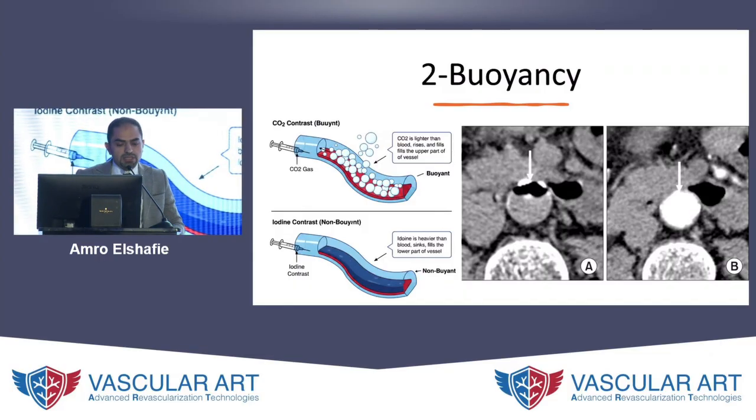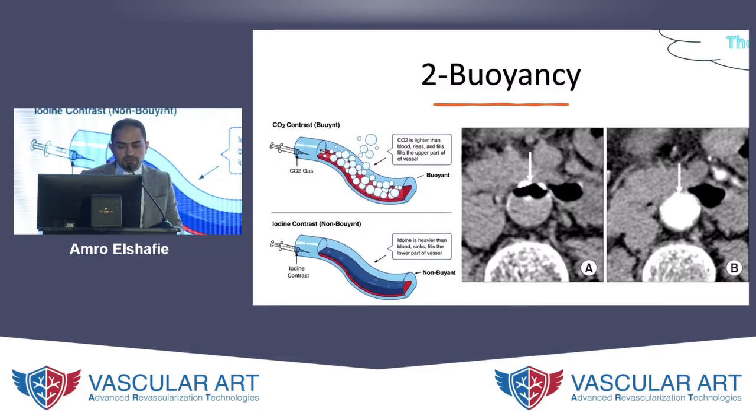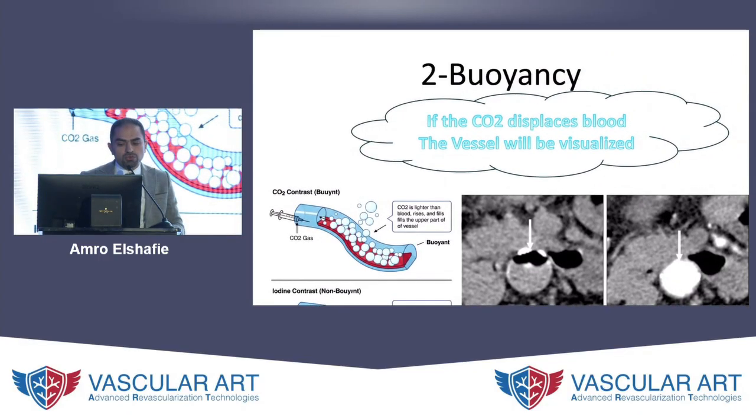Regarding buoyancy, when we inject CO2 inside the artery, it actually doesn't mix with the blood, as this picture describes, unlike the iodinated contrast material. So if the CO2 displaces the blood, the vessel will be visualized.